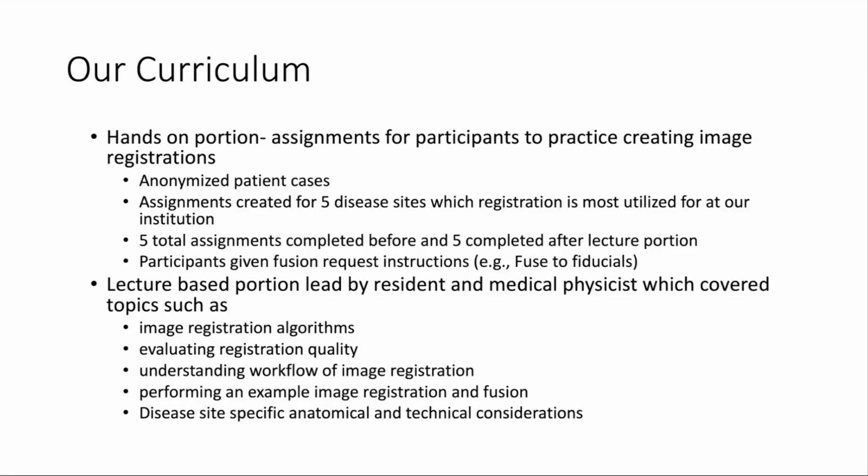So our curriculum consisted of a hands-on portion, which was assignments created for participants to practice image registration, to help them create image registrations. How we did that was we anonymized real patient cases to create these assignments. They were created for the 5 major disease sites. I'll discuss how we got those a little bit later. With each assignment, participants were given fusion request instructions. So for example, for the prostate case, they were given instructions to fuse to the fiducial markers.